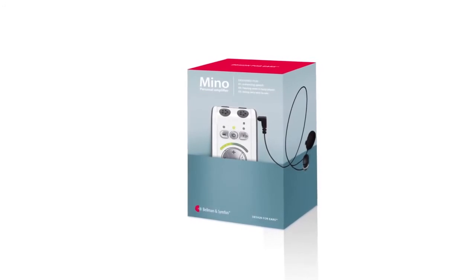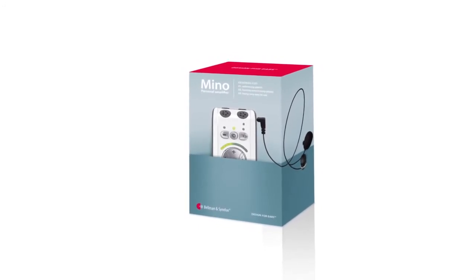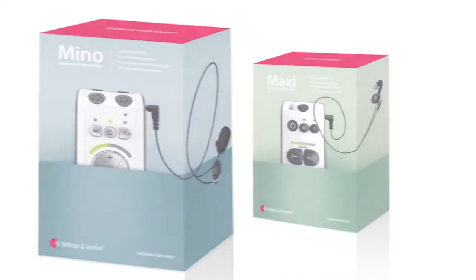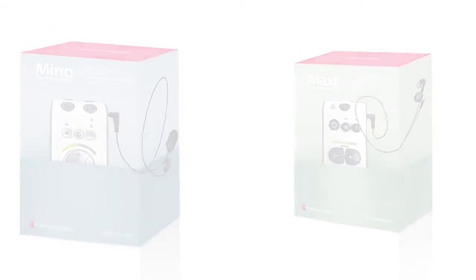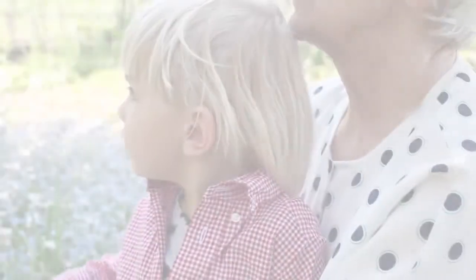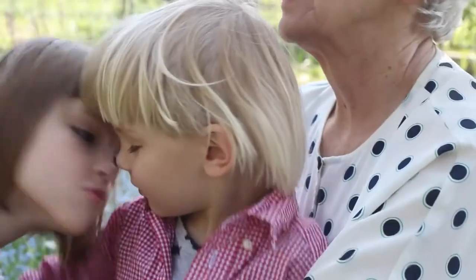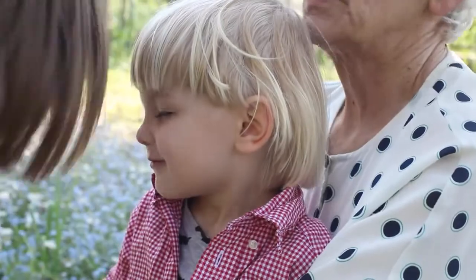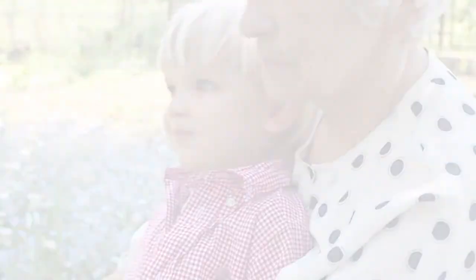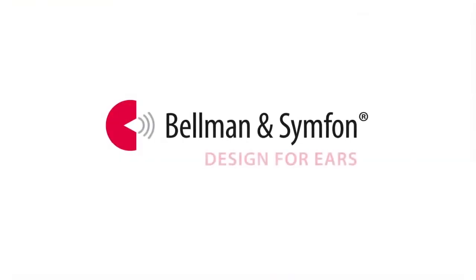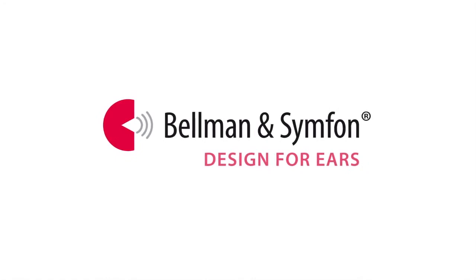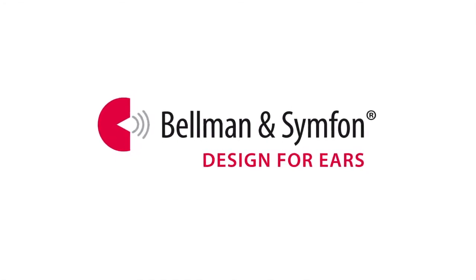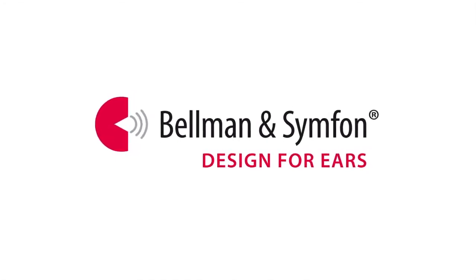Mino is a great choice for those who spend a lot of time outside their home. The new generation of personal amplifiers from Bellman & Symphon offers a great listening experience at a very affordable price. Try it and discover the joy of better hearing.